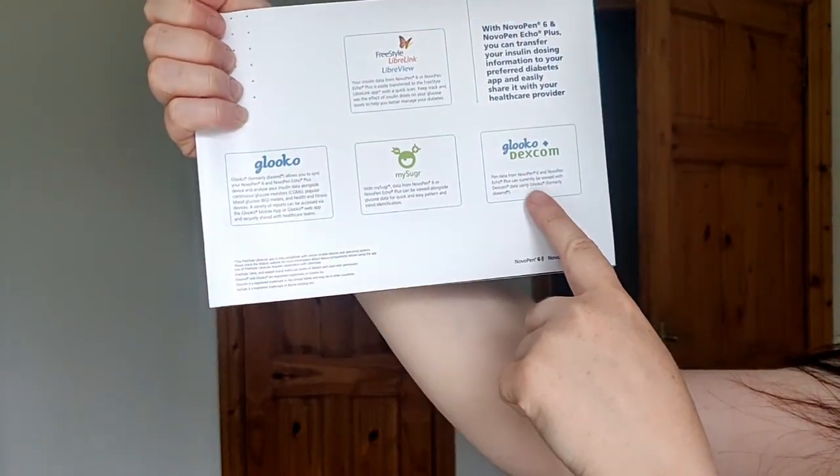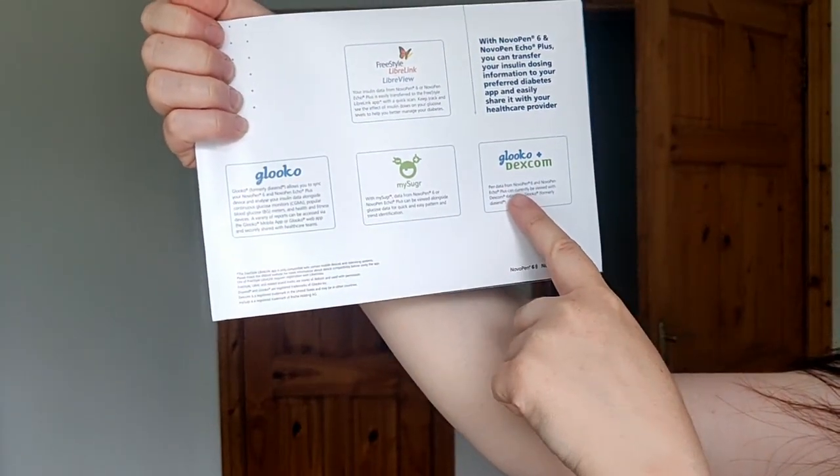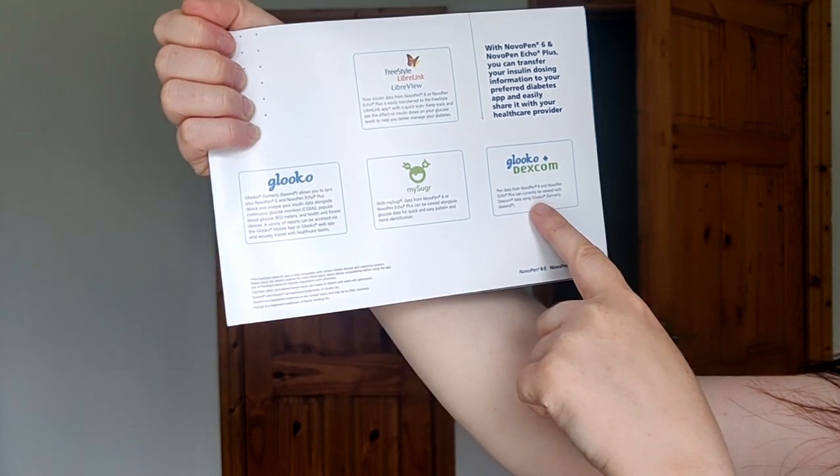It's Dexcom time! I have one on — it's been bleeding a bit so it ruined my cow patch vision — but we want to get the smart pen working with the Dexcom. I'm going to download the Gluco app because it says Gluco plus Dexcom: 'pen data from Novo Pen 6 and Echo can be viewed with Dexcom using Gluco.' My blood sugar is 5.5 which is really good. I'm going to download the Gluco app now and see if we can get it working.